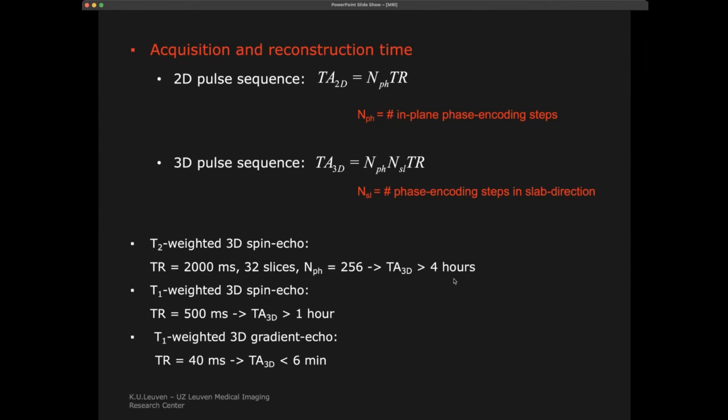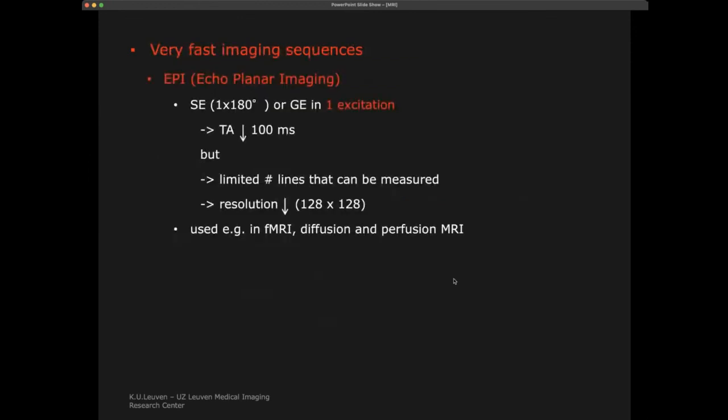They either emphasize T1 or T2, they have better contrast, or they might have better spatial resolution. And as we will see further, you can even emphasize some other things that can be relevant for the imaging. Currently, there are also low resolution but very, very fast imaging sequences being used.